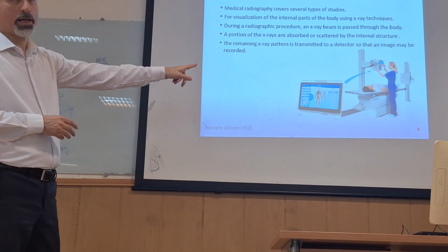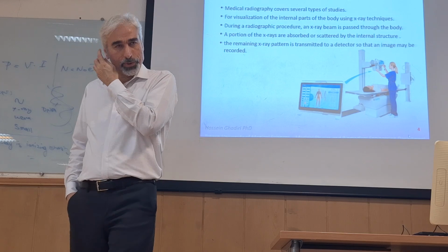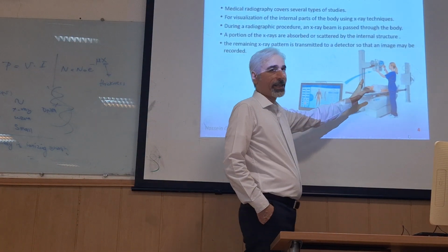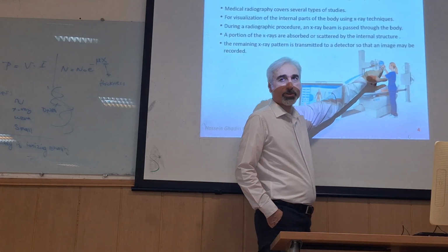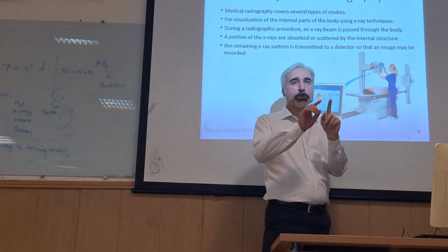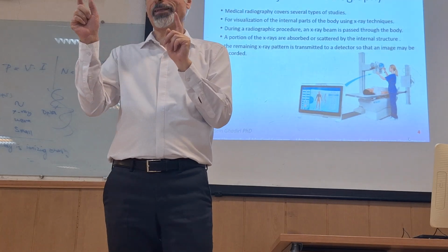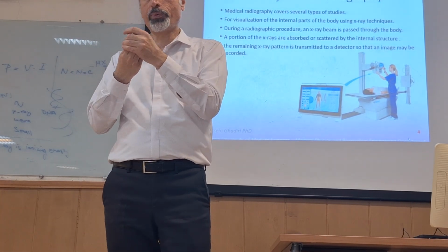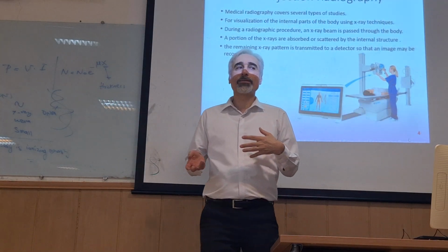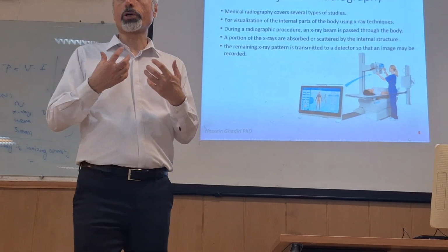This is the image of the machine. Mostly, the appearance is the same. There is a stand here and the X-ray source on the top. And you can see the operator trying to adjust the mA and kV and the exposure time. These three main parameters are important, depending on the patient size and where the operator wants to image, which organs.